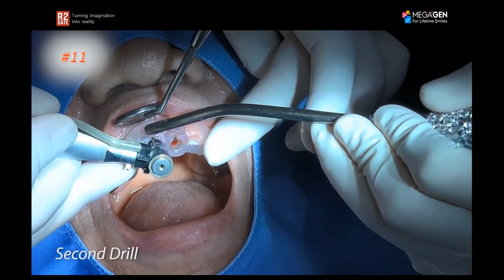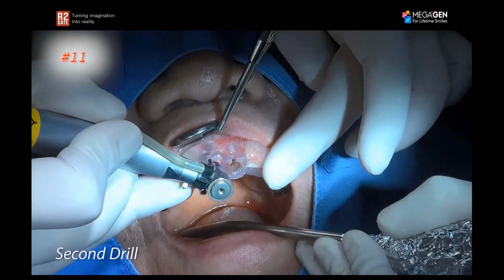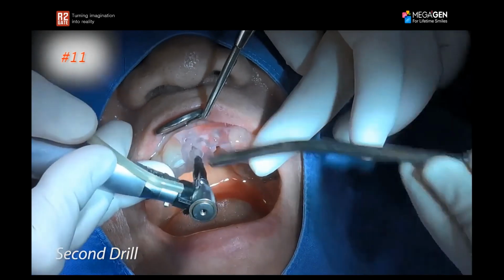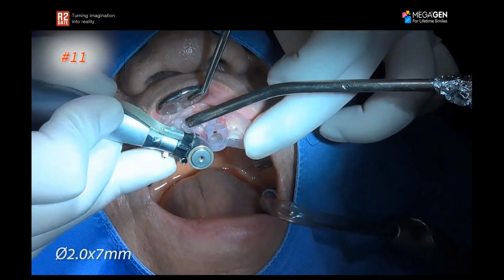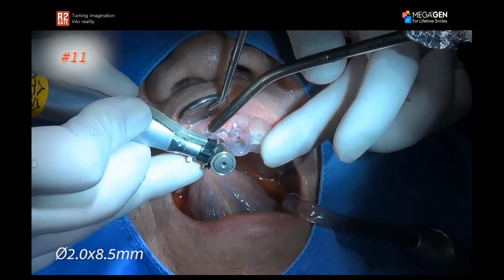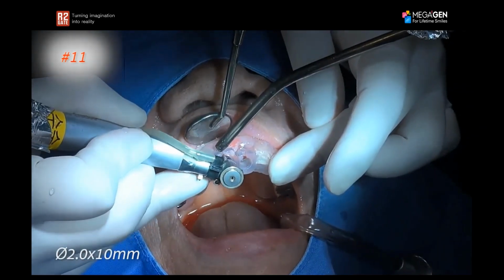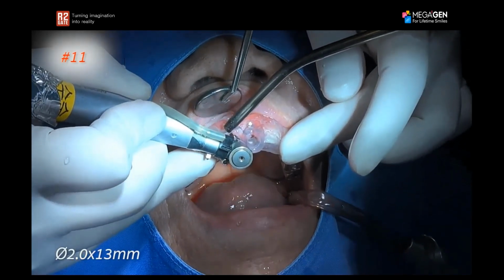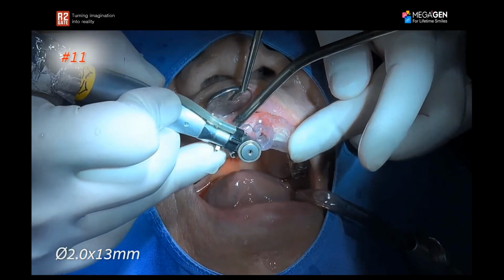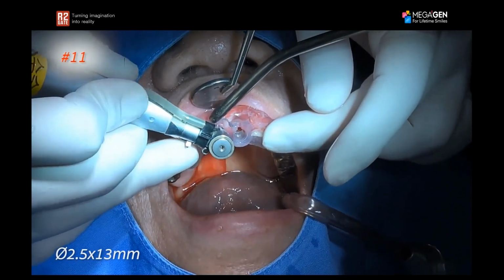I'll do the same workflow. I'll make sure that I start drilling with the initial, then second drill. And then I start to increase the length of my osteotomy incrementally by starting with the narrowest, shortest drill, and then I'll work my way up to the longest drill. Here, my final drill is going to be 13 millimeters in length. After I reach 13 millimeters, I can start to increase the diameter of the drill.